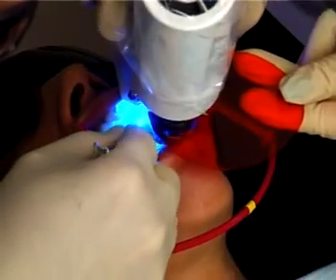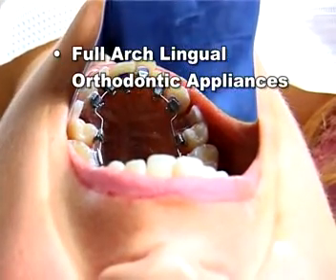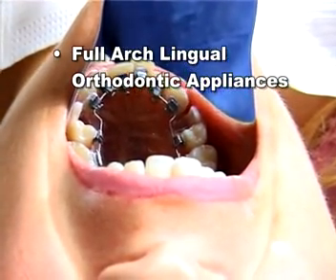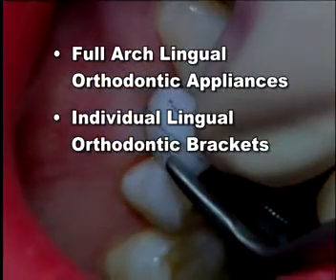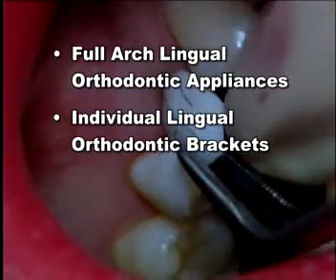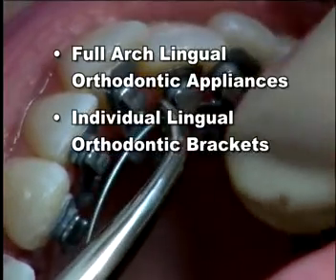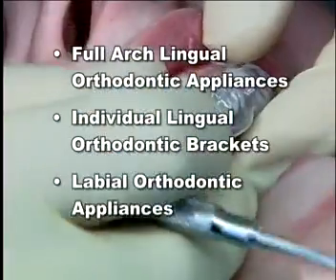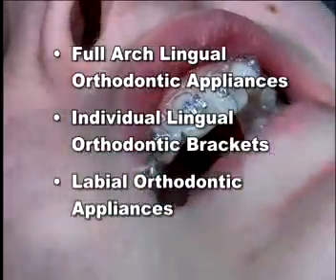This video will show you how easy we can make the bonding of full arch lingual orthodontic appliances, individual lingual orthodontic brackets on individual teeth, placement of temporary false or pontic teeth in extraction situations, placement of lingual arch wires, and the indirect bonding of labial orthodontic brackets and the placement of bands if required.